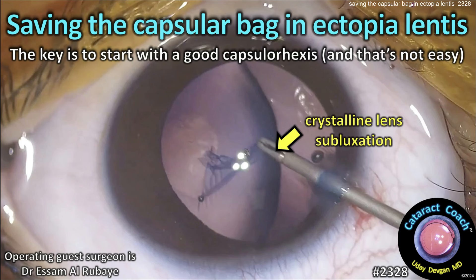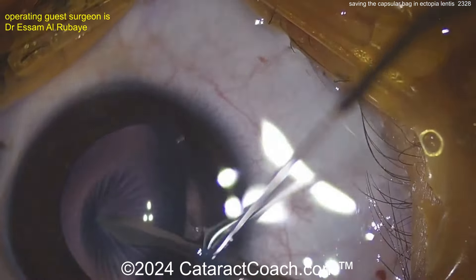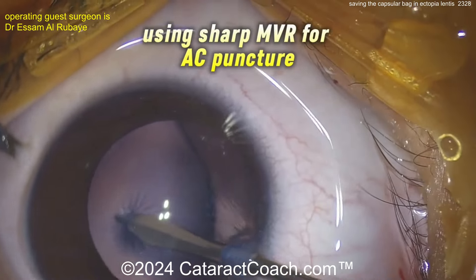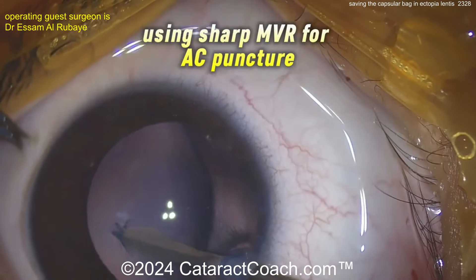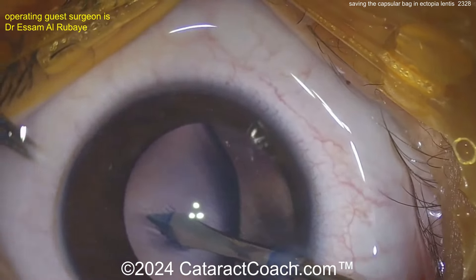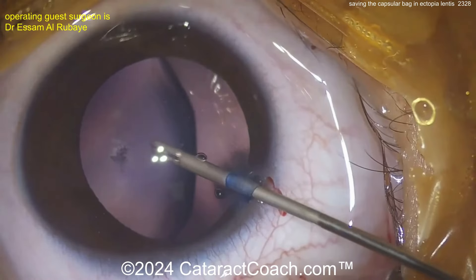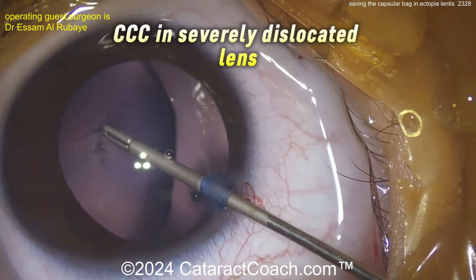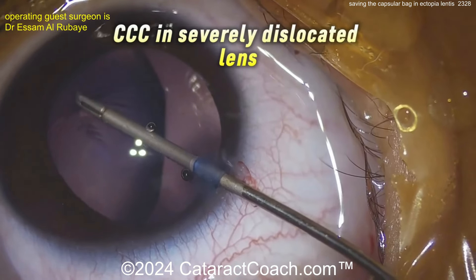cataractcoach.com — saving the capsular bag in ectopia lentis. The key is to start with a good capsulorrhexis, and that's not easy. Here's the case — look how difficult it is to poke into the lens capsule. Using a sharp MVR blade for the anterior capsule puncture — you could also use a cystitome — but because you have such lax zonular support here, the capsule is loose, as we say.